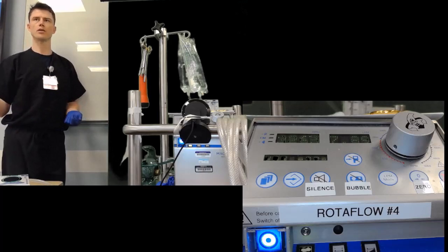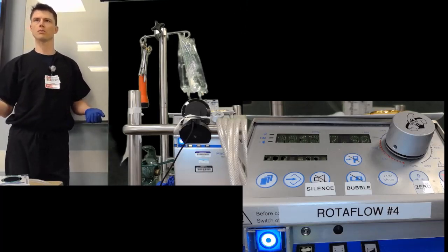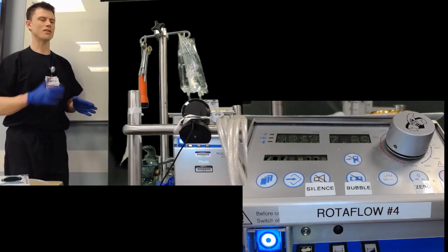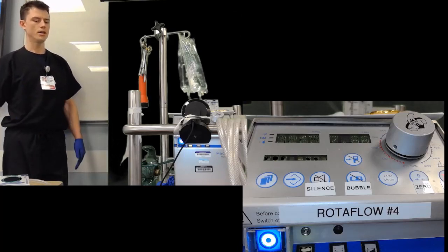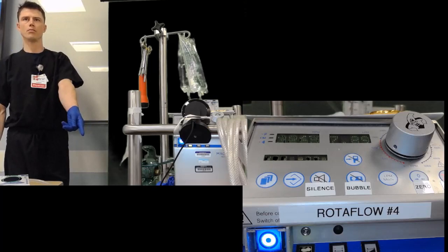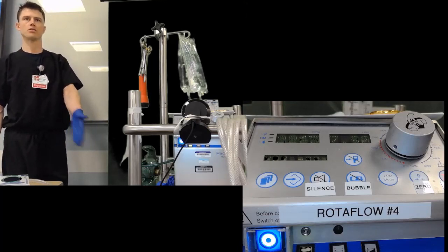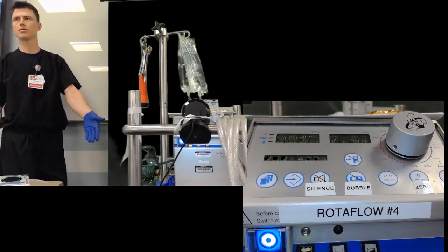They changed out the Foley for a different one, and then the temperature was normal, so it was a malfunction of that. It was kind of what doesn't make sense, like ask why and change out your equipment. And like they said, one of the warmers was malfunctioning, and so that was causing some of the issues. So changing that out might be the right answer.